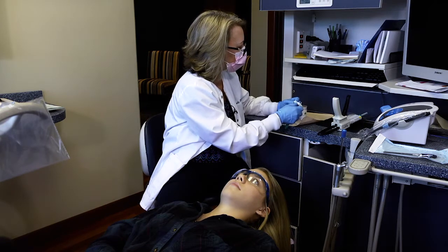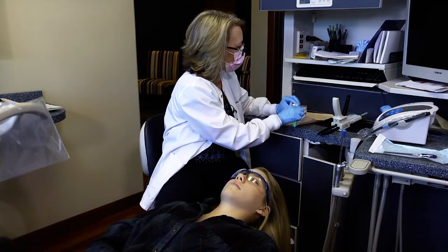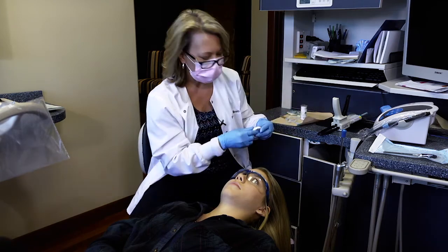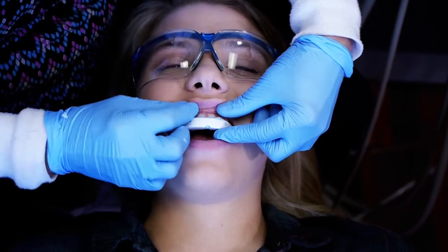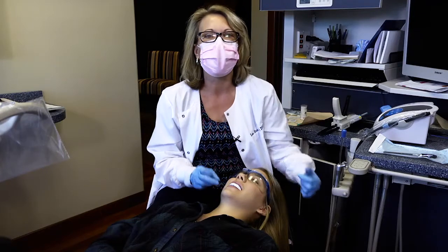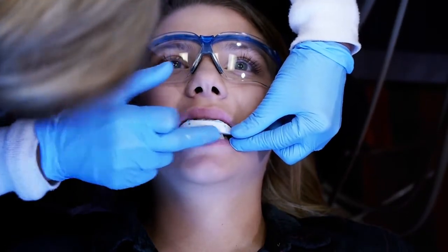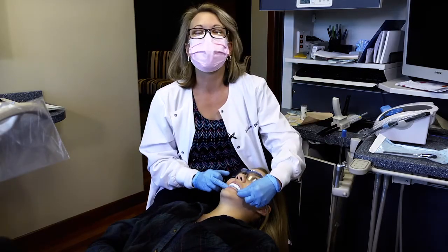On the anterior, if material has gone out over the labial of the quick splint, we can trim that as well so Jenna's upper lip isn't being caught on it — we want to make it as comfortable as possible. Once trimmed, I take it back in and try it in, making sure I've got enough retention. I like feeling a tiny little snap where the bite registration locks in slightly over Jenna's teeth. I have her bite again to verify contact on both canine cusp tips, with none of her back teeth touching.